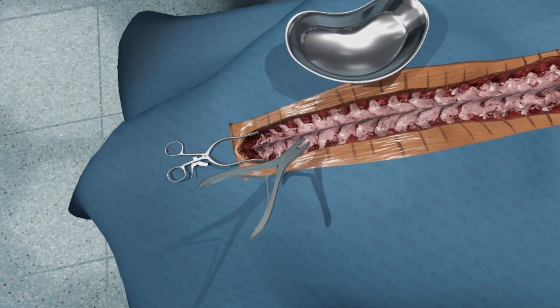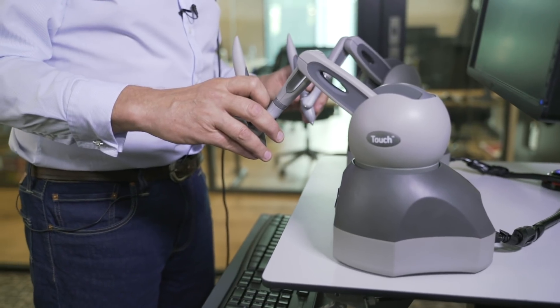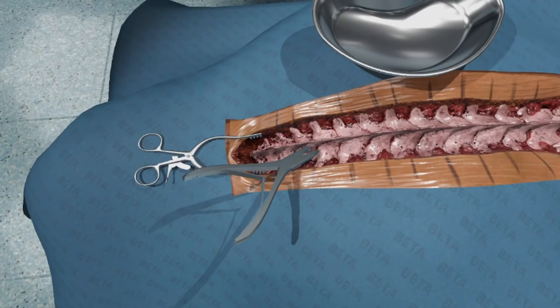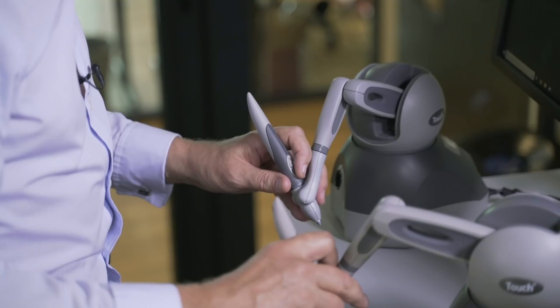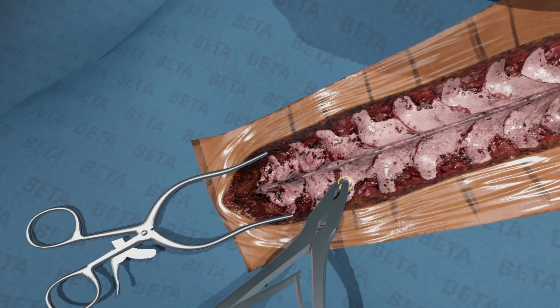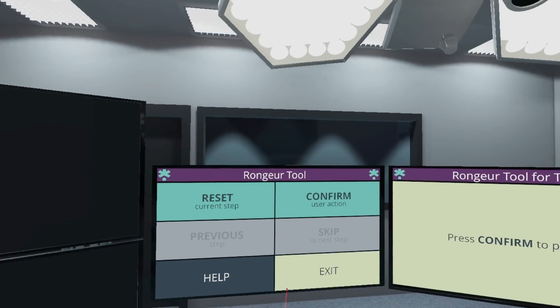I'm using the rongeur tool to start with, and that's haptically enabled so I can feel each of the vertebrae on the spine and the soft tissue around it also. First I'm going to take a small piece of bone from there and confirm that I'm ready.